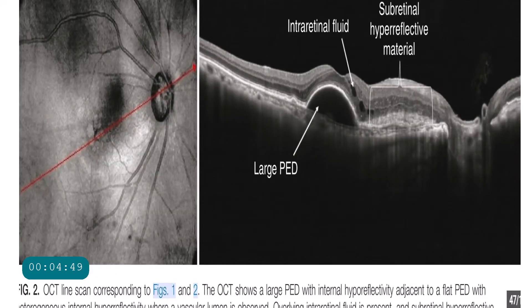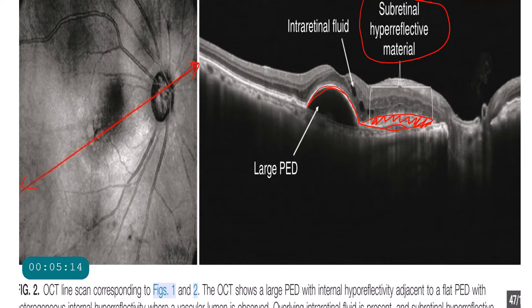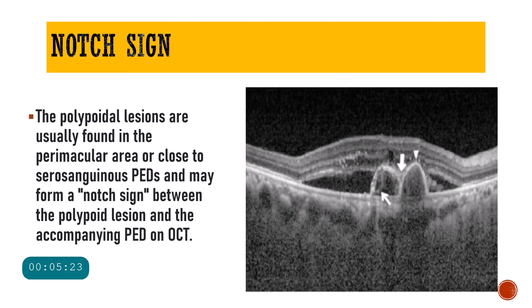In this line scan picture, you can see a large pigment epithelial detachment, and here you also have a small pigment epithelial detachment. You can see hyper-reflective subretinal material present here. This PED is also leaking and there is intraretinal fluid also located in this area.